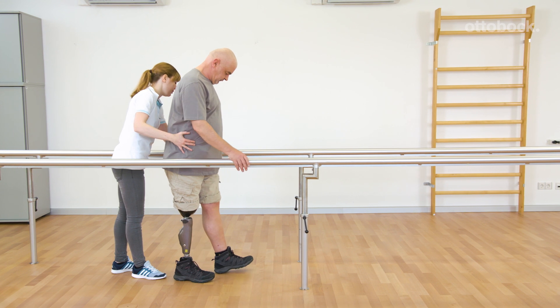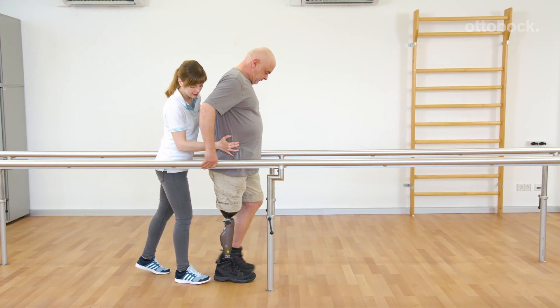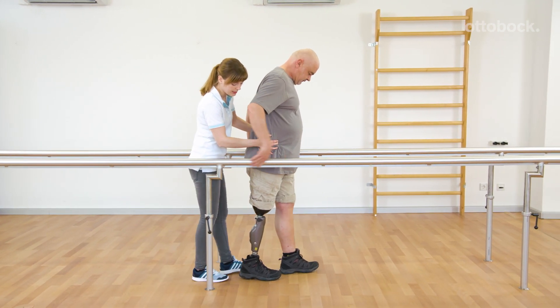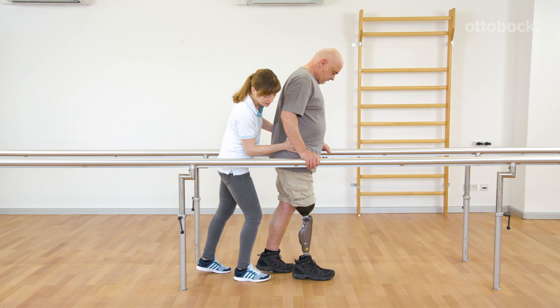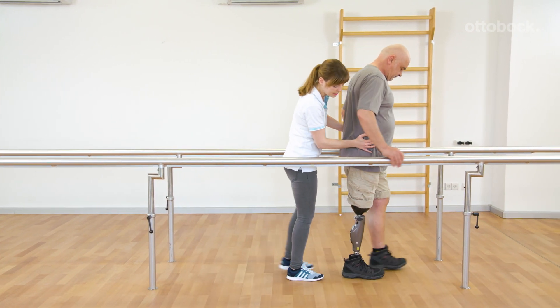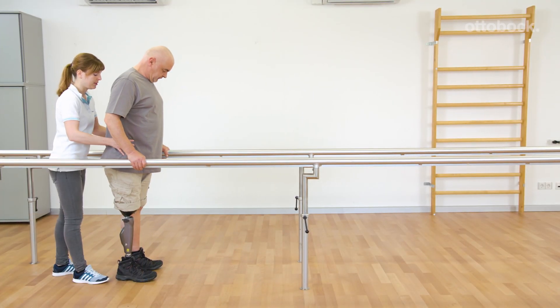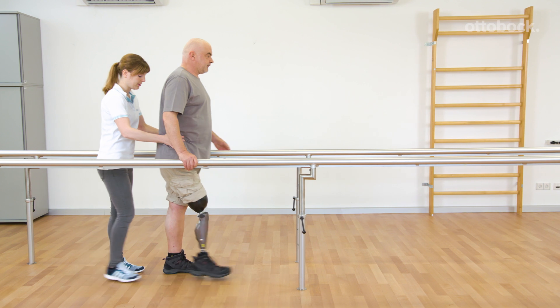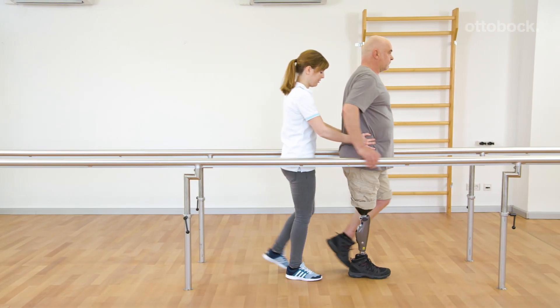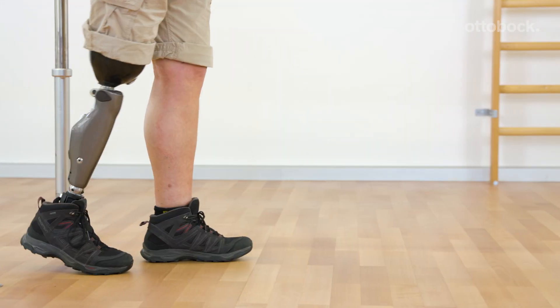Gerhard tries to use the motion sequence during consecutive steps. It requires time and training to integrate this natural knee flexion. Consciously walking with stance flexion should be trained over and over again, especially when walking outside of the parallel bars and during outdoor training.